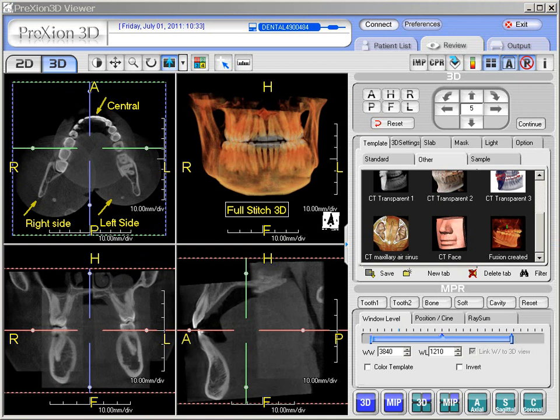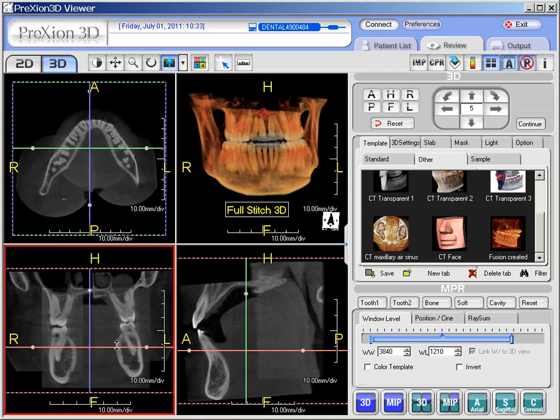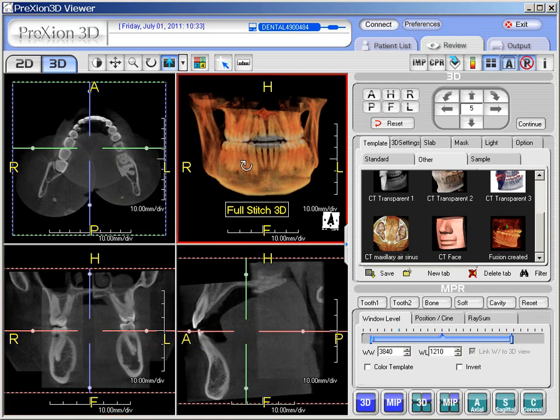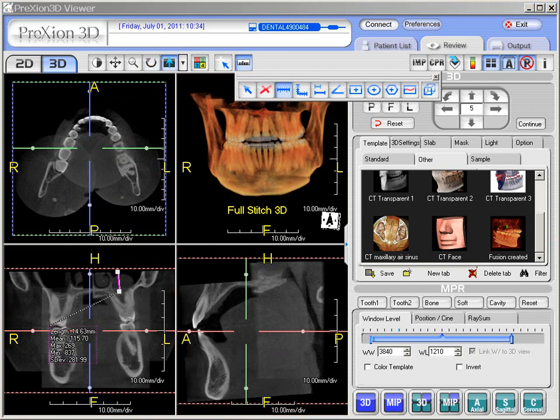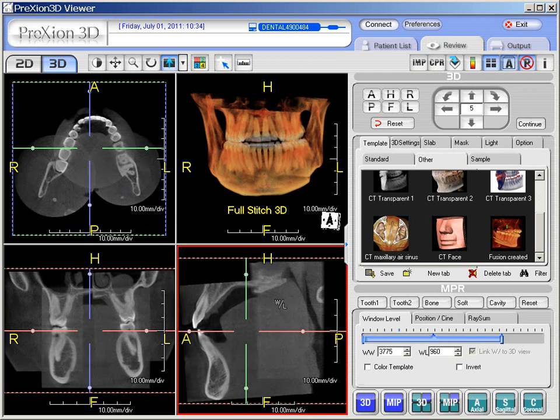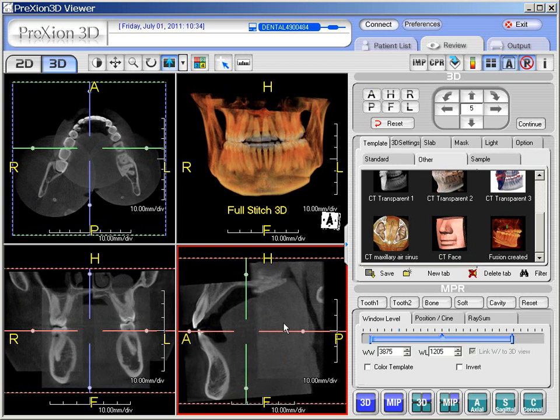This new data set of the stitched three data sets is fully functional for the slicing ability, rotation of 3D, if one wants to access measurements, or adjust window level settings. It is all fully functional within this new data set that's fully DICOM compatible and can be exported to third-party software.